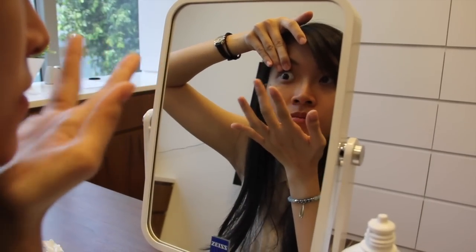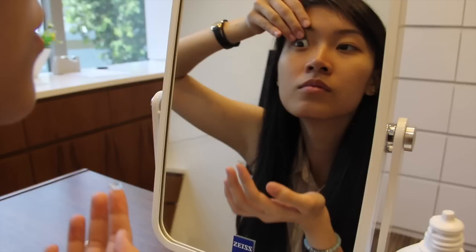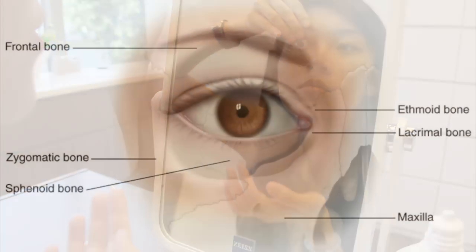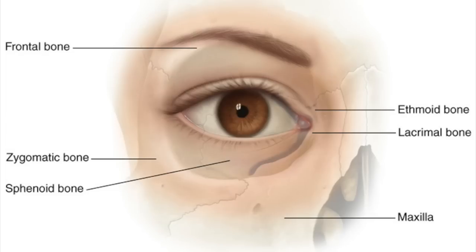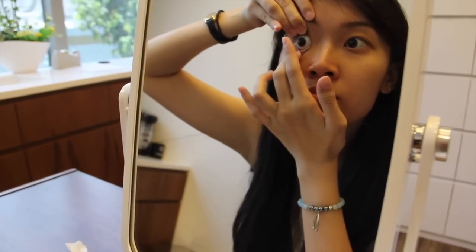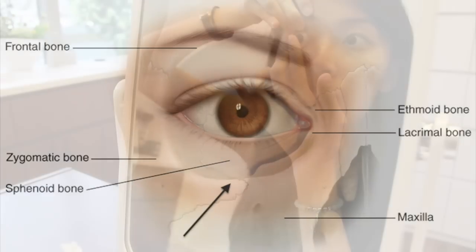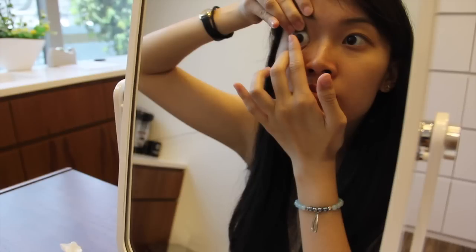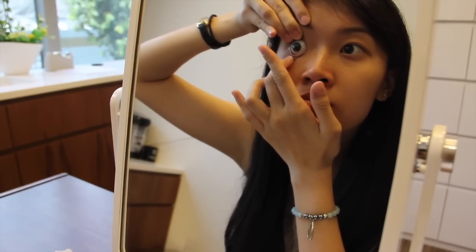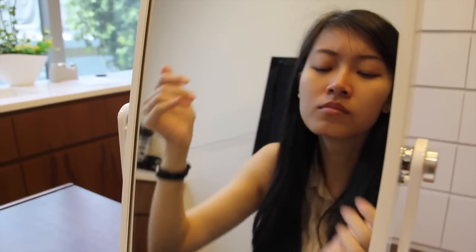Use your middle finger of the other hand that is not holding the lens to pull the upper lid. Hold the lid margin and lift it until you feel your orbital bone, about one to two centimeters away from your eye. Do the same for the lower lid and hold it against the lower orbital bone. Do not release the eyelids immediately after the lens is in the eye. Instead, look down and around to ensure the lens is centralized before releasing the eyelids.